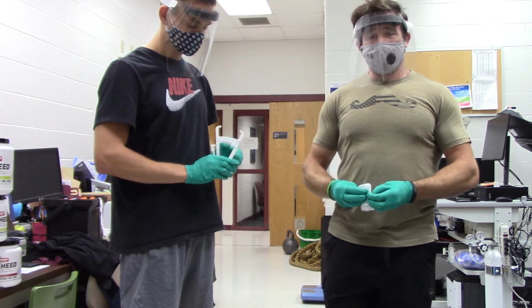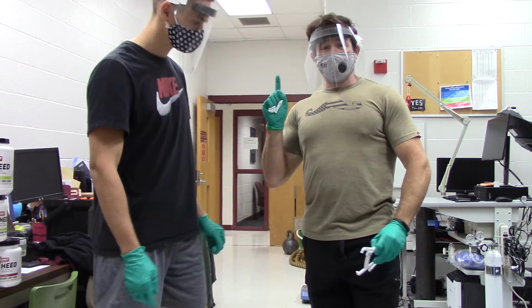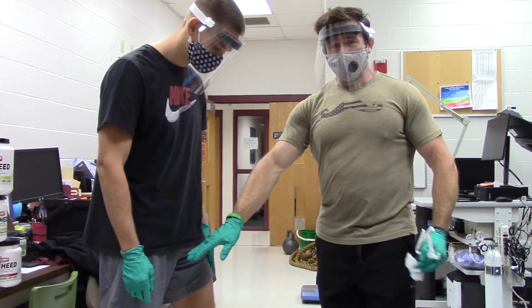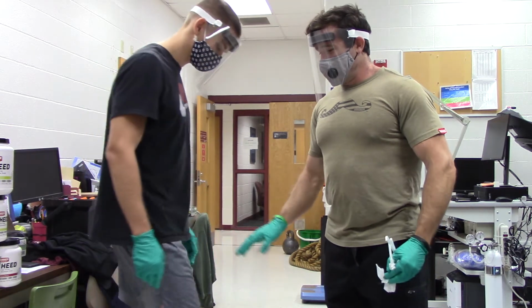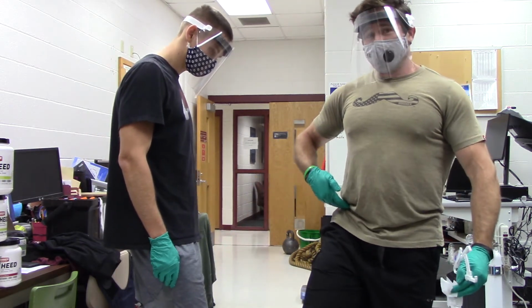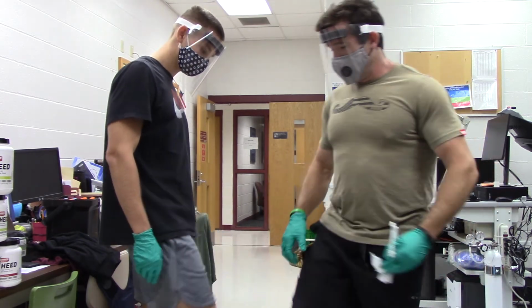Now the last two we're going to go ahead and do are going to be the thigh. The reason we're doing the thigh is Ihor is tall, so we don't have to go as far. So he's going to put all of his weight on his, switch legs for me, bud, on his left leg, and then he's going to offer me this right leg. Half the distance between the inguinal folds, so when you bend our knee, to our actual knee, that's where we're going to go ahead and measure.